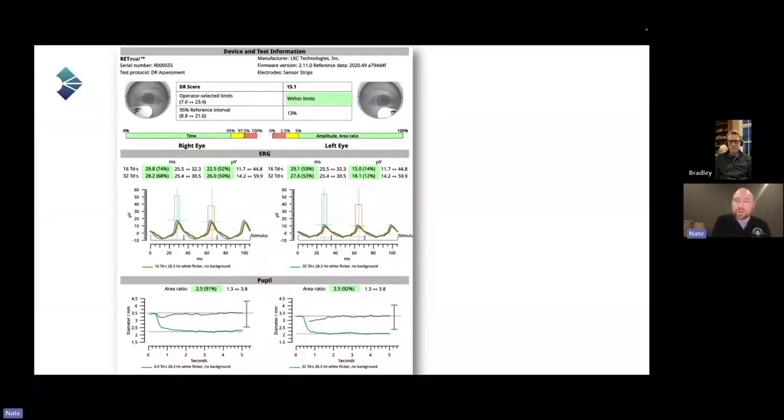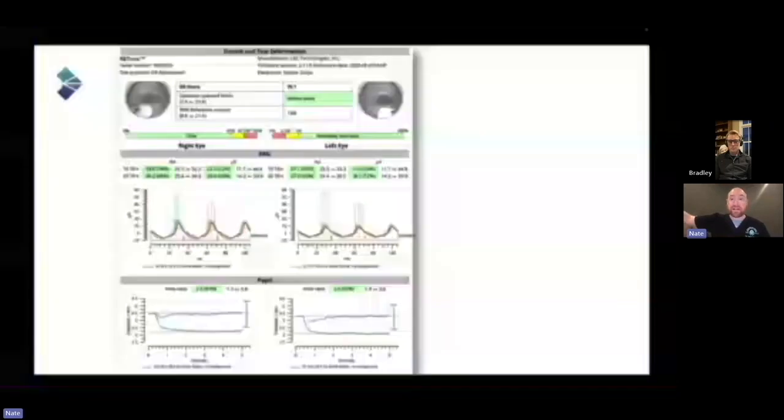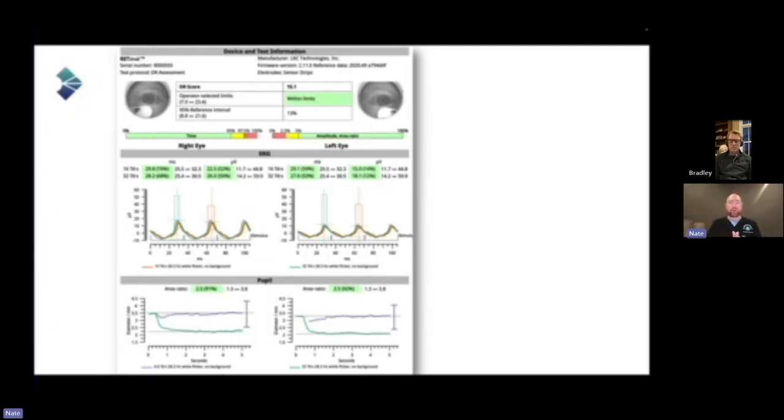23.4 and lower is normal. 23.5 and higher is abnormal. And really, I break that down even more. If it's in the teens, I consider that normal. If it's kind of 20 to 23, that's borderline. Still normal. It's low normal, borderline. And 23.5 and higher, that is abnormal. And you get above 26, and that's really abnormal. The retina is having an impending attack going on, which we'll talk more about in just a second.